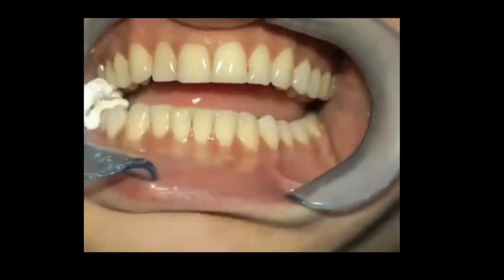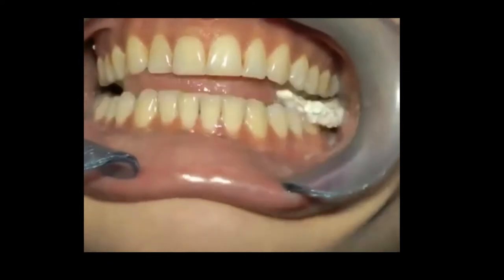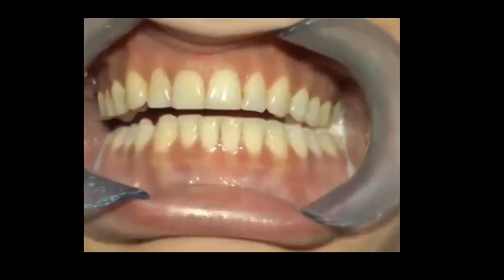It's chewing gum. Look at that nice chew cycle. And it goes both ways. See? It went clockwise, now it goes counterclockwise, but it's in the shape of a teardrop.